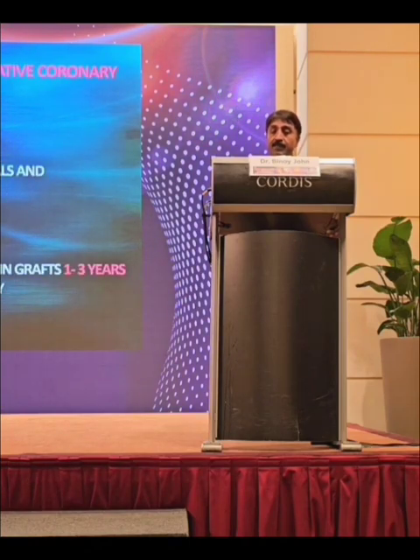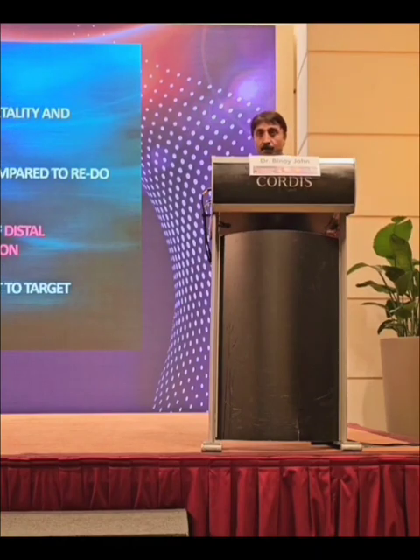So, the common bypass grafts that are used are the saphenous vein grafts and the internal mammary grafts. Coming to saphenous vein graft angioplasty, SVG degeneration is unique and different from native coronary stenosis. The SVG blocks are large, soft and friable, lipid-rich, with large necrotic debris, and they often lack a fibrous cap and calcification, and often have overlying thrombus. Atherosclerotic blocks start appearing in the SVG 1 to 3 years following a CABG surgery, and the degeneration increases thereafter with time.